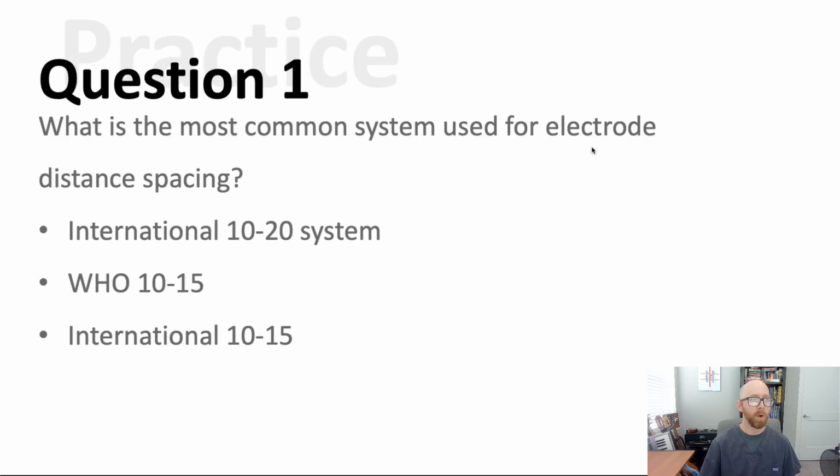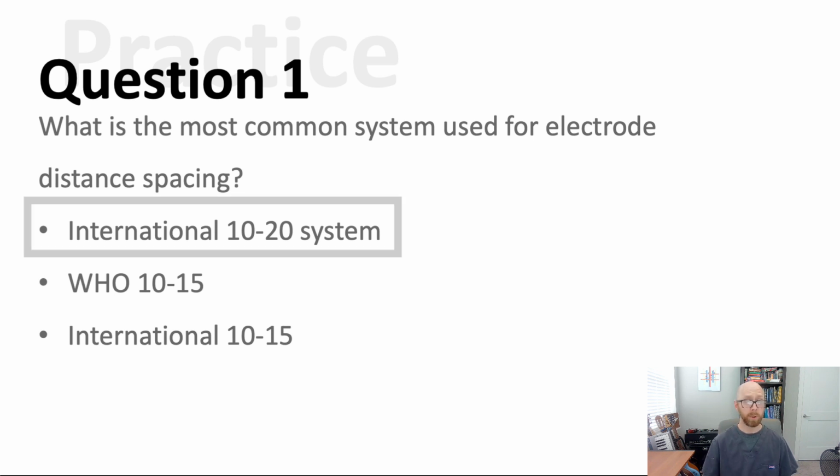Question 1. What is the most common system used for electrode distance spacing? Is it the International 10-20 system, the WHO 10-15 system, or the International 10-15 system? If you answered the International 10-20 system, you'd be correct.